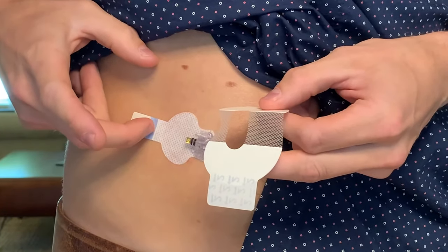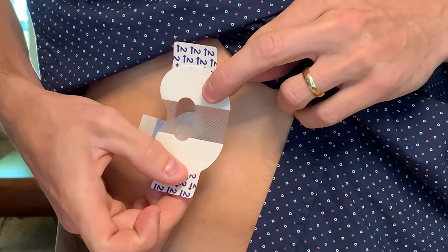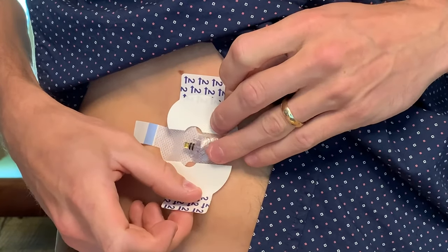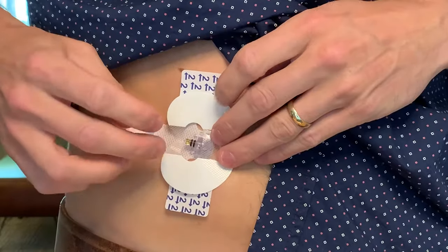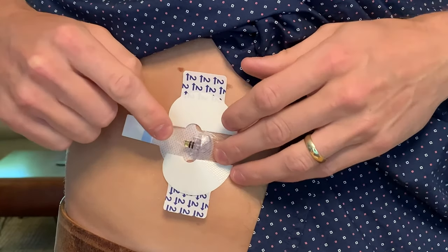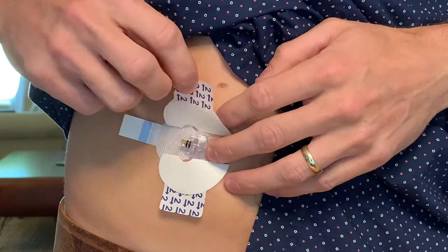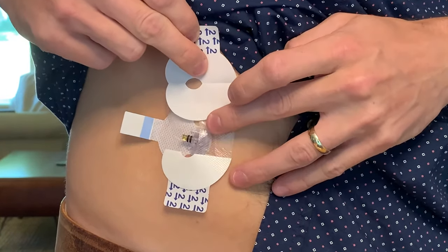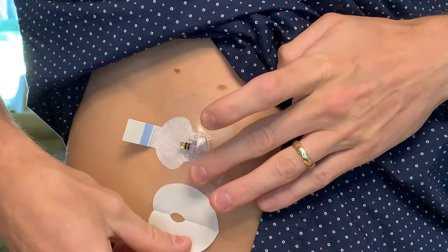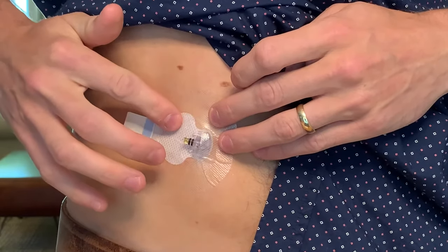I'll flip the tab to make sure that the tape does not cover it, and I'll put the tape so the wide part covers about half of the sensor and the other half is on my skin. It's important not to block the connector here. I'm applying gentle pressure on the tape to help it stick. Now I can take off the liners labeled number two.